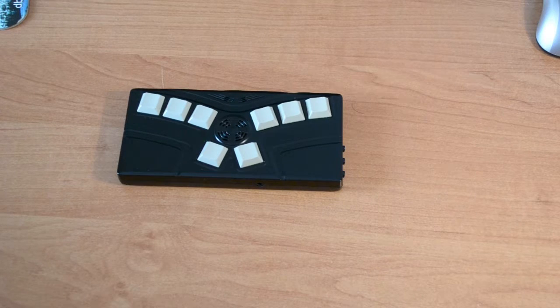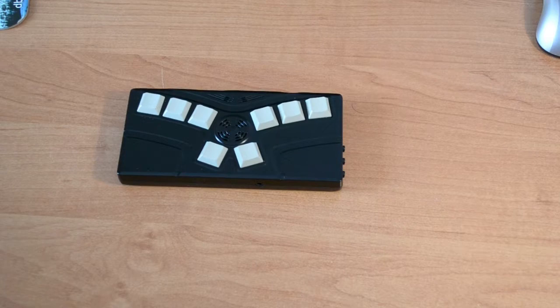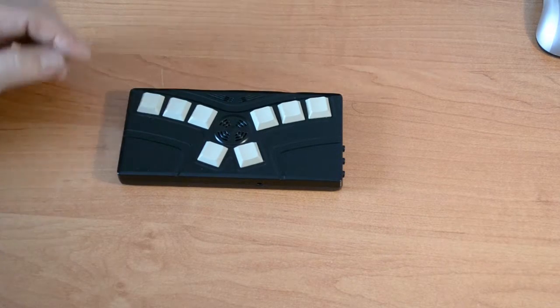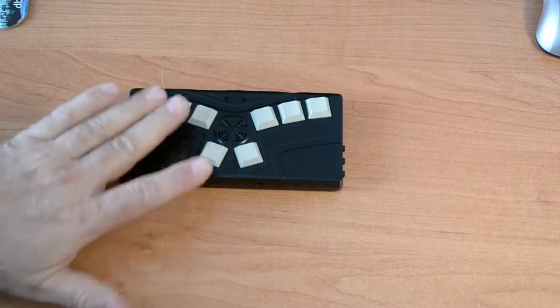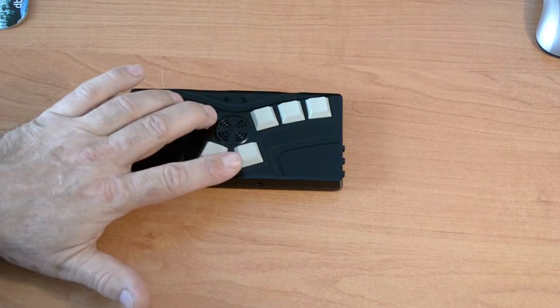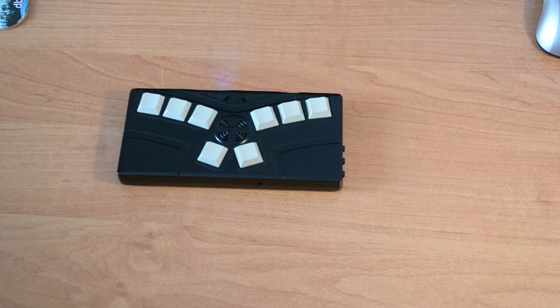Now I show you how simple it is to connect it to the computer through Bluetooth and how we can drive the computer. To connect it to the computer, we have to switch on the Bluetooth in this device and go to the list of authorized devices. So we just press the letter B, dots 1 and 2, and we get a message: Do you want to add a new device to the list?